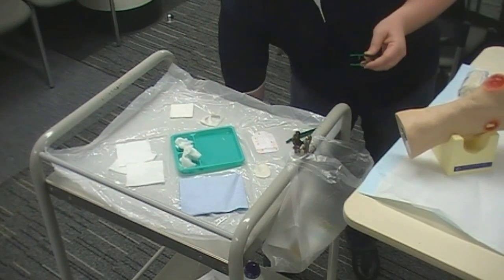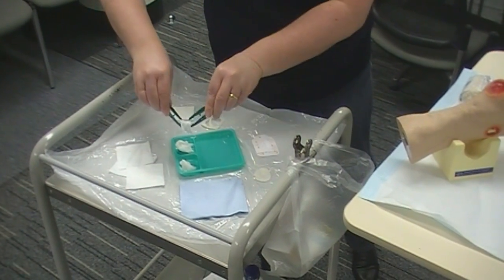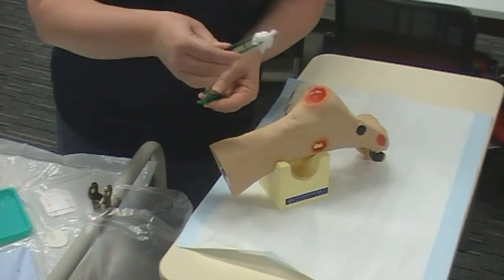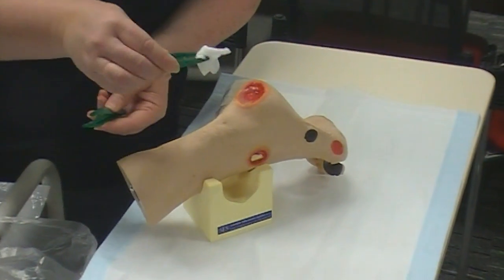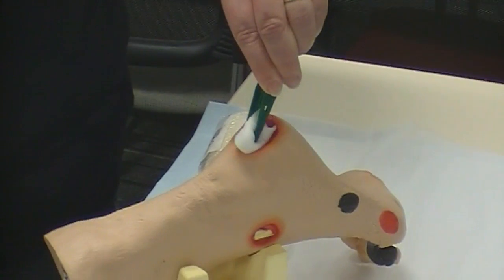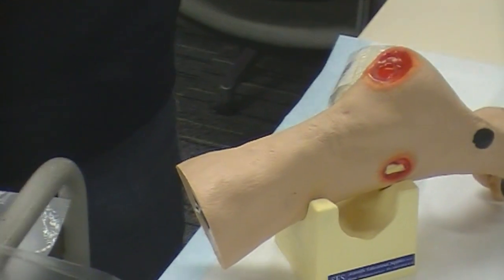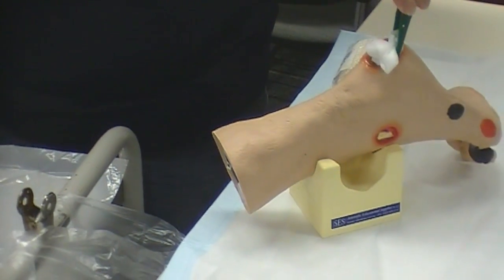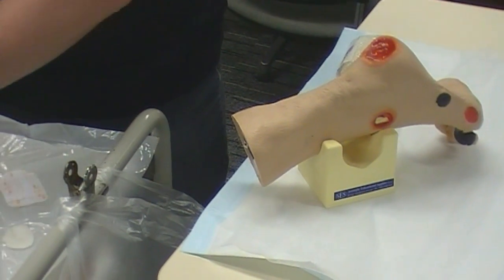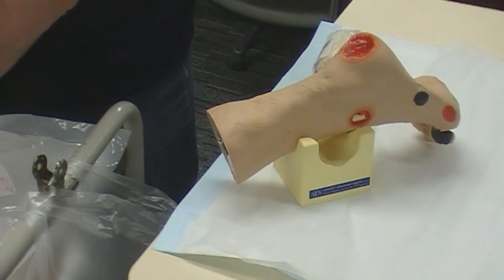Once I've done that, I'll get rid of my scissors because I don't need them now. I'm going to give the wound a clean — this one's actually quite nice and clean. As it's a rounder wound with a little bit of depth into the centre, I'm going to use a circular motion and come out from the centre. It's one motion without lifting. You may need to do that multiple times depending on the wound. Once you're happy that it's as clean as you can get it, we're going to dry that in the same method.